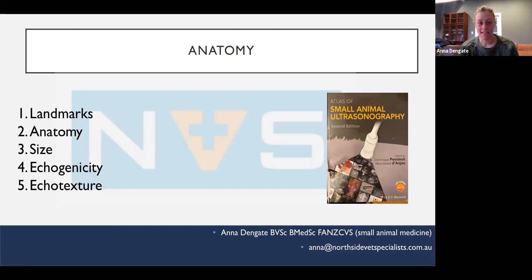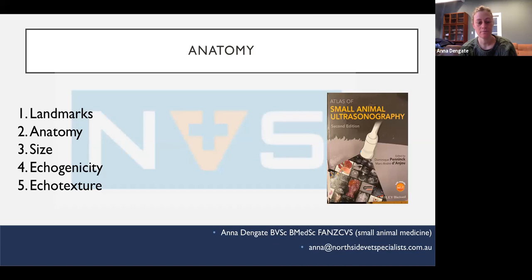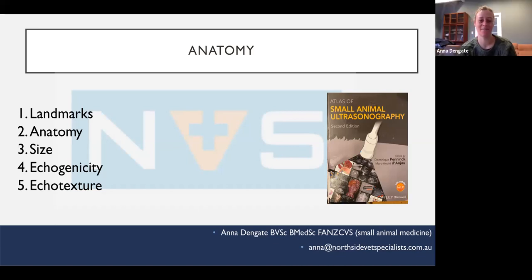So realistically, can you separate the lobes on ultrasound? I don't think I've ever been able to necessarily. It's pretty rare. If there's fluid there, you're more likely to. Good, exactly. It's kind of nice sometimes when there's fluid there to do a little anatomy prac and check the position of the lobes, and then try and extrapolate from what it looks like when there's fluid there to when there's no fluid there, and assume that it's probably that lobe if you're seeing an abnormality that's focal in the lobes.